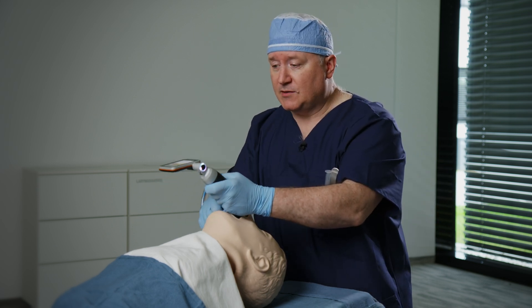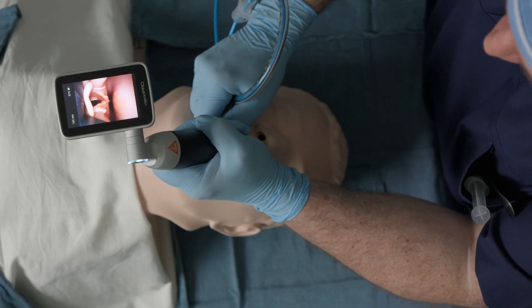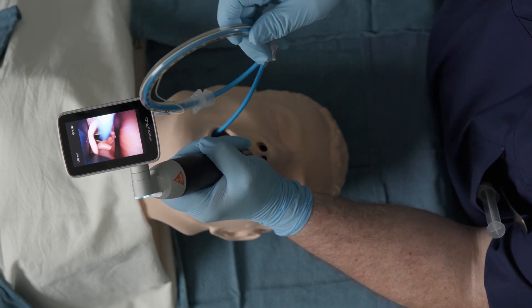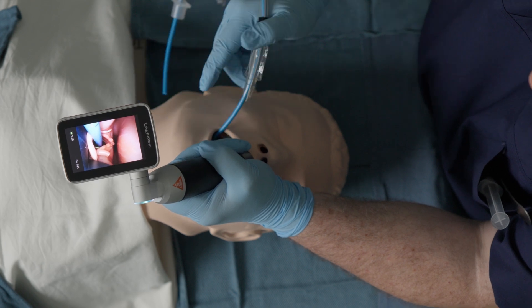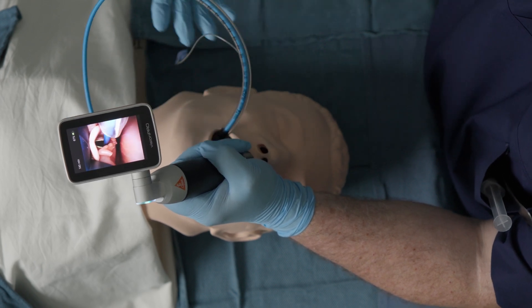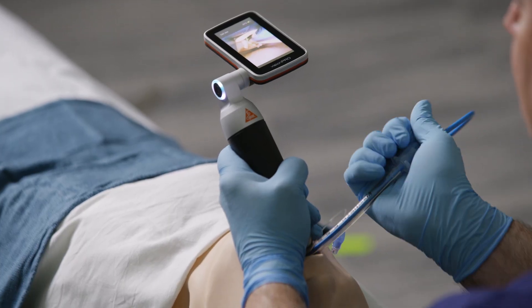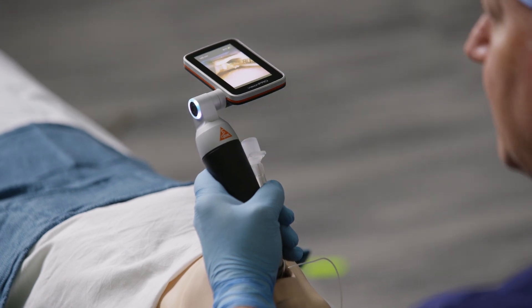I'll begin by performing the laryngoscopy on the mannequin. I want to make sure I get to that vallecula and expose that larynx. What I can now do is deliver the bougie with a simple motion of the arm, remove the tail of the bougie, and then advance the tracheal tube with a leftward twist to avoid impingement on the right corniculate cartilage. I'll now grasp the tracheal tube and remove the bougie myself with this technique.